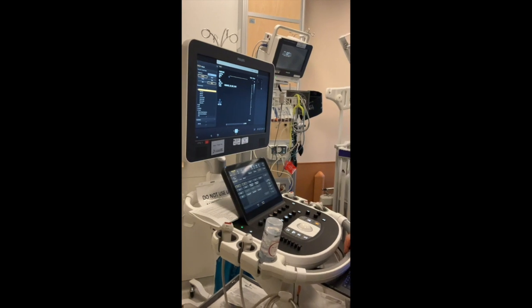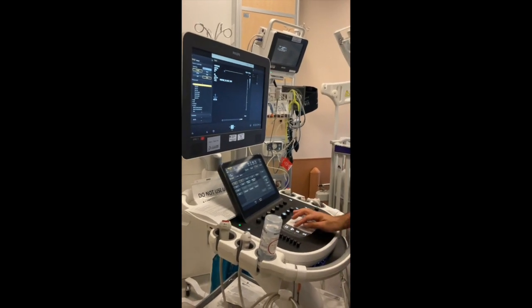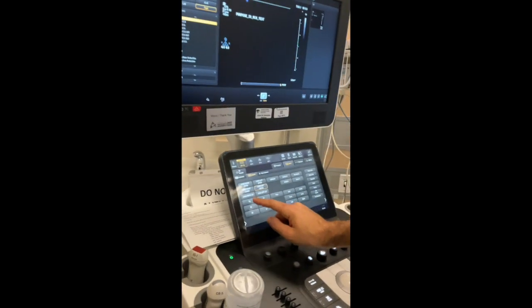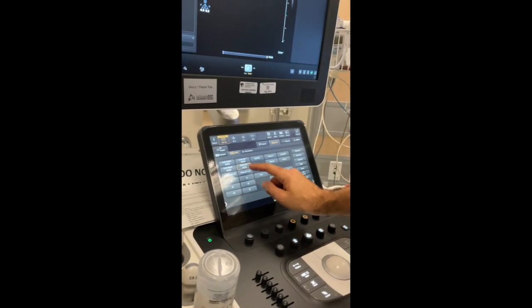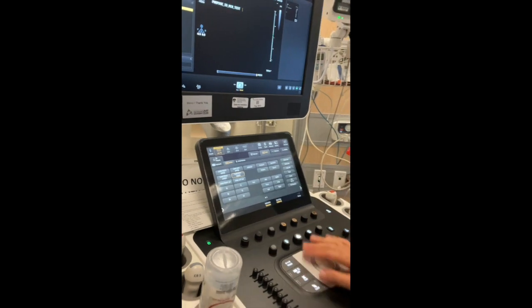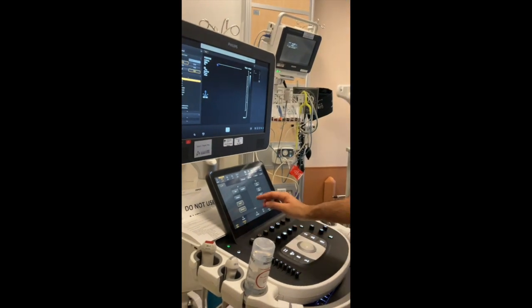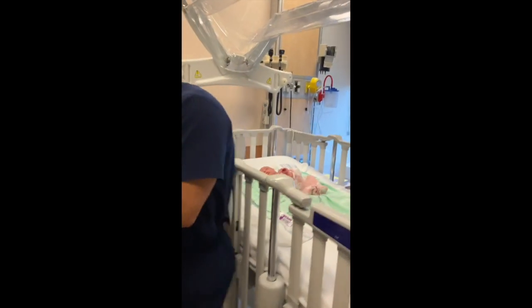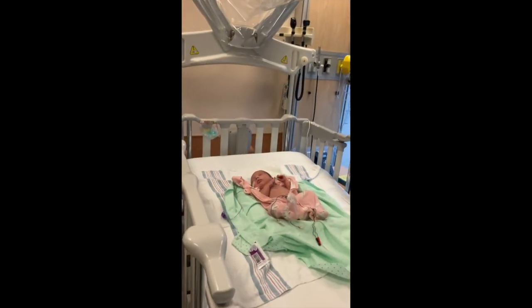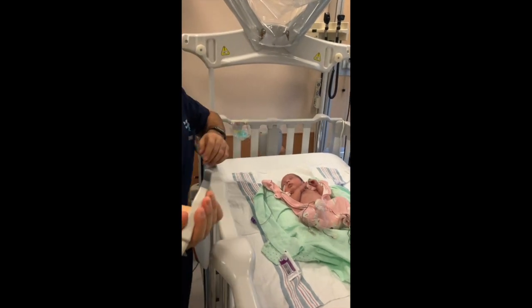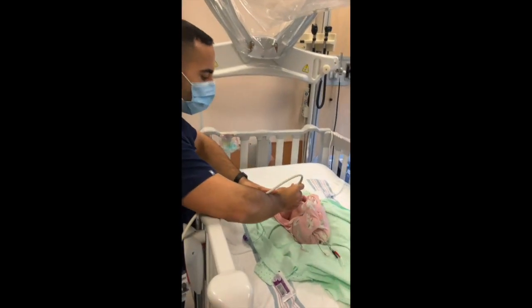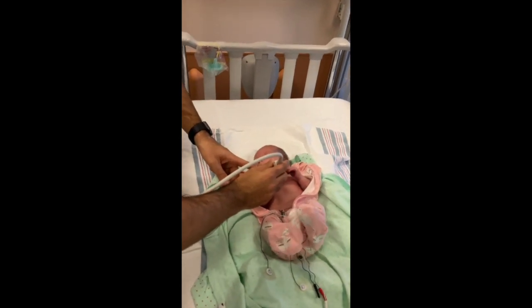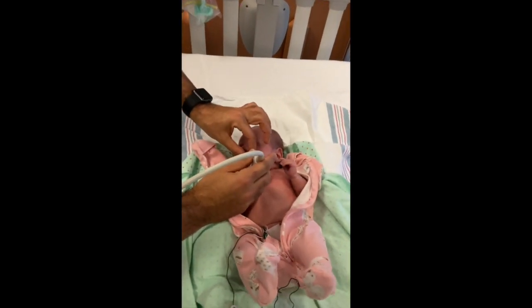I'm going to clear and then label. I have here: right upper, right lower, right lateral, left upper, left lower, left lateral. I'm going to start with the right upper lobe label. I'll take my clean linear probe. The idea is to have the orientation towards 12 o'clock, which means longitudinal towards the head — towards cranial.